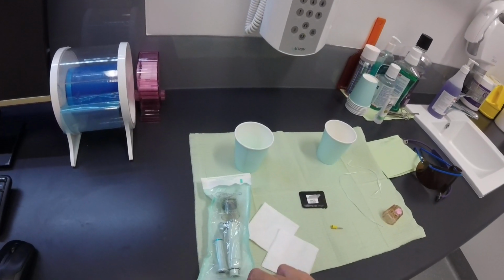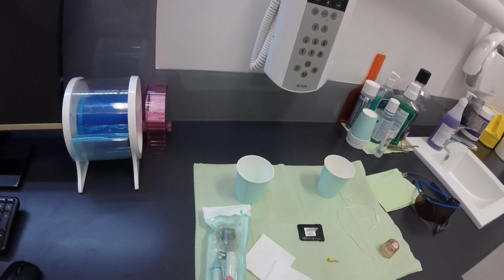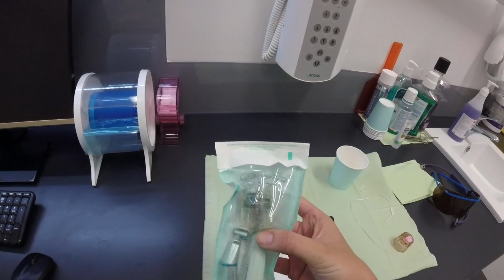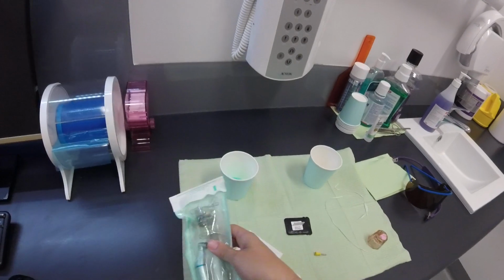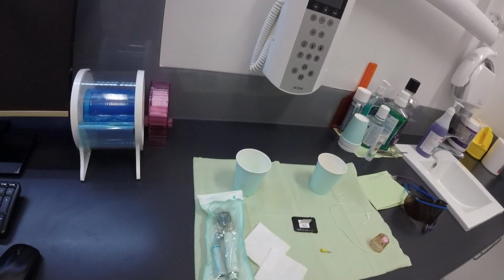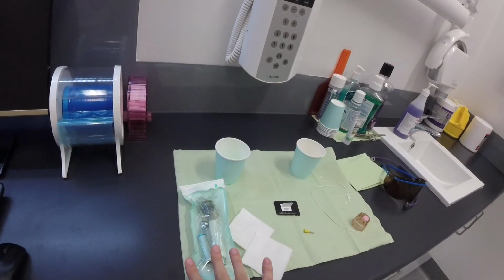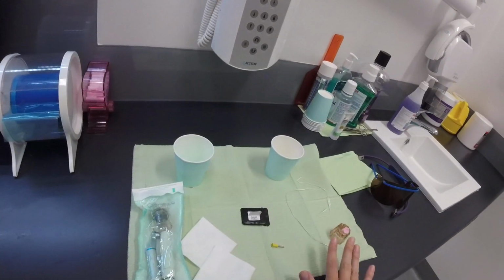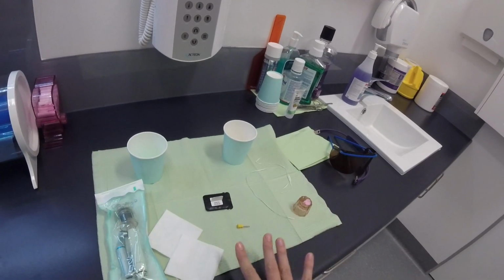So next to this slow speed, we have the scaler tip and the adapter piece. So that's the ultrasonic. This is the one, not sure if you can see, but there's a little tip. That's the one that vibrates and shoots the water and helps get all the scale off the teeth. So we usually have this clicked into the chair. I will show you that in a moment. So slow speed, ultrasonic, Prophy paste, and Prophy wheel are what we've got out for our dentist to use.